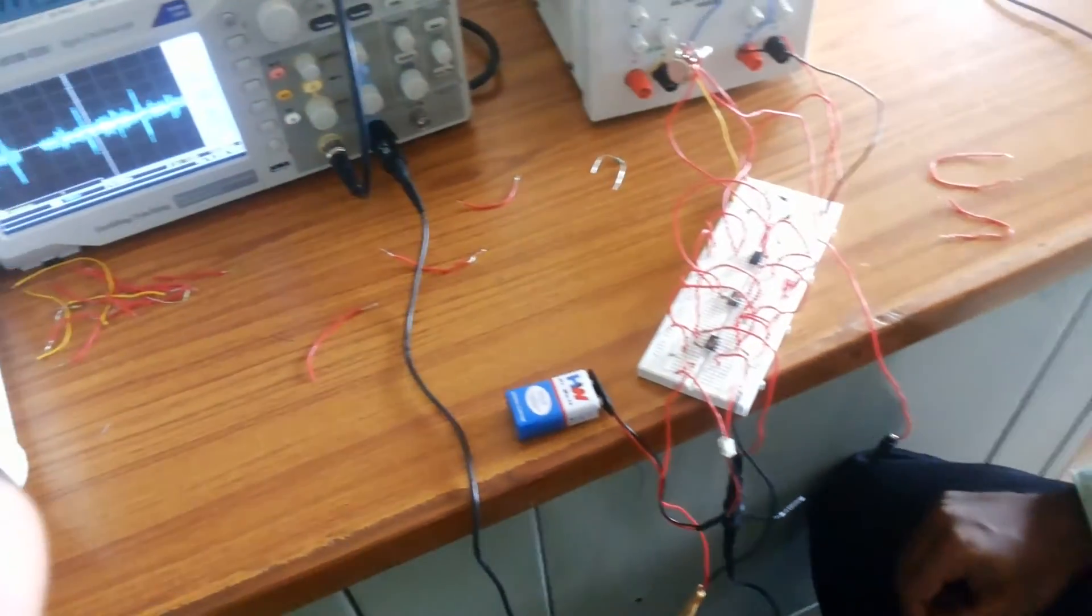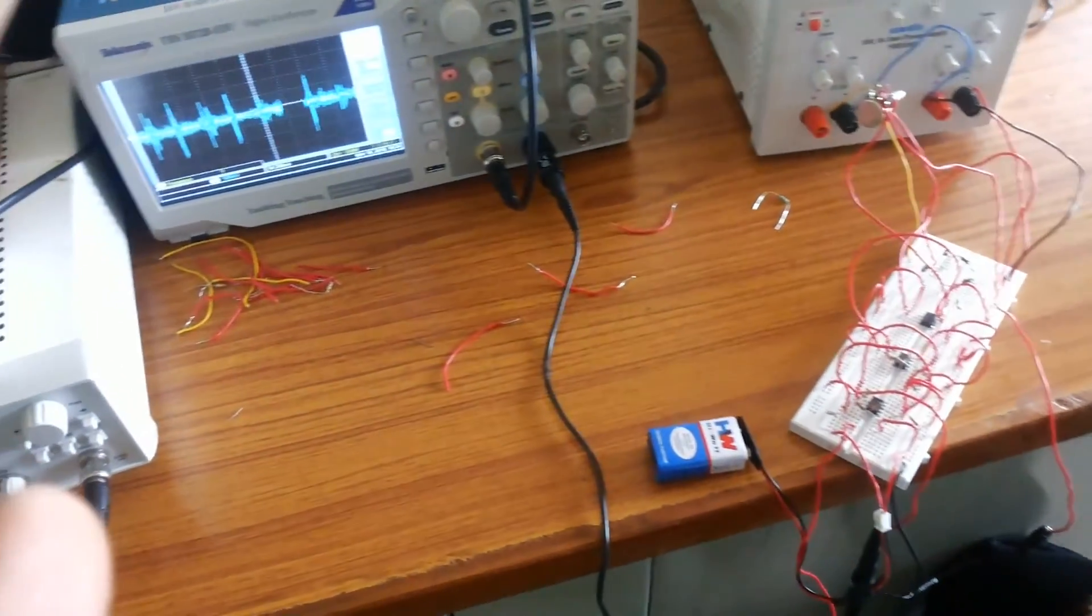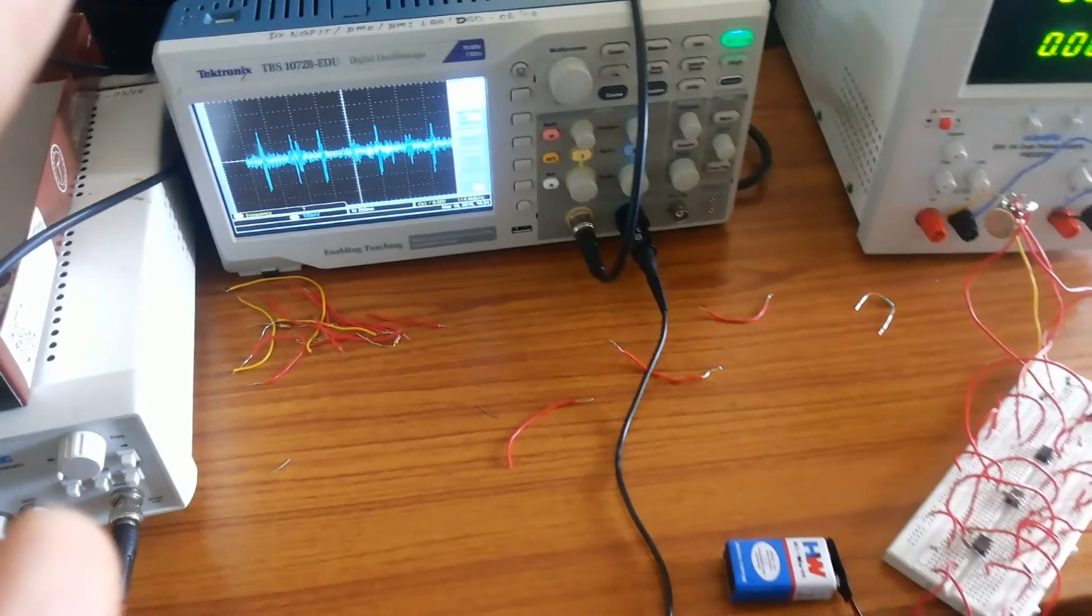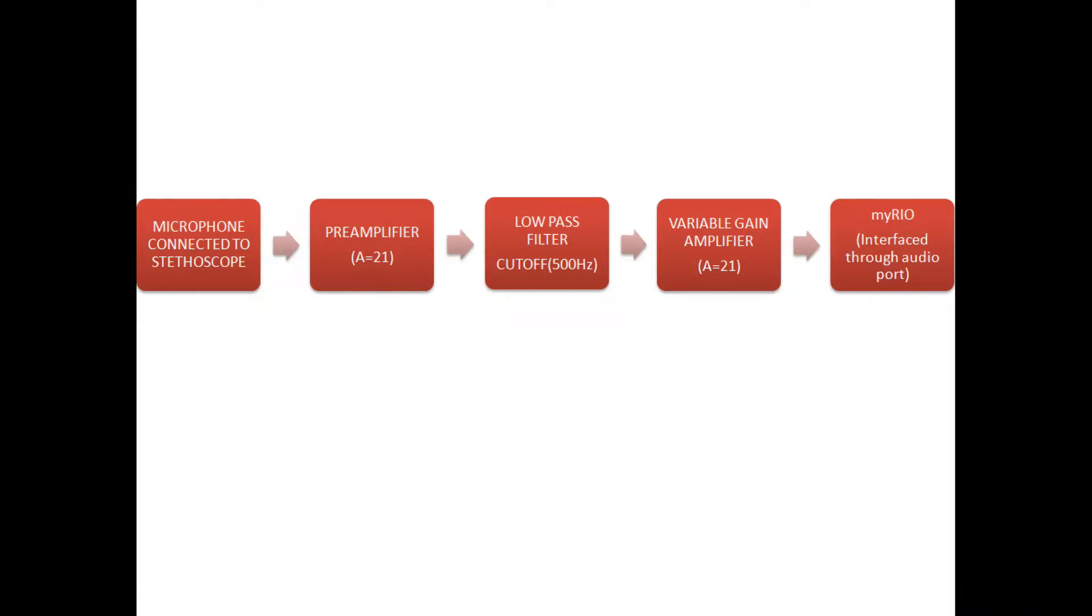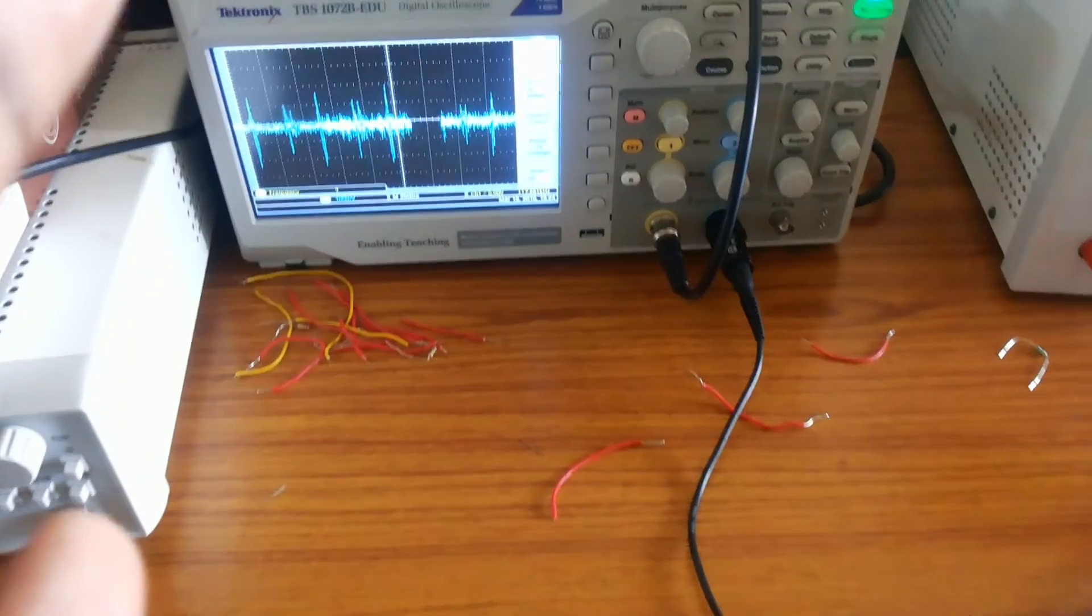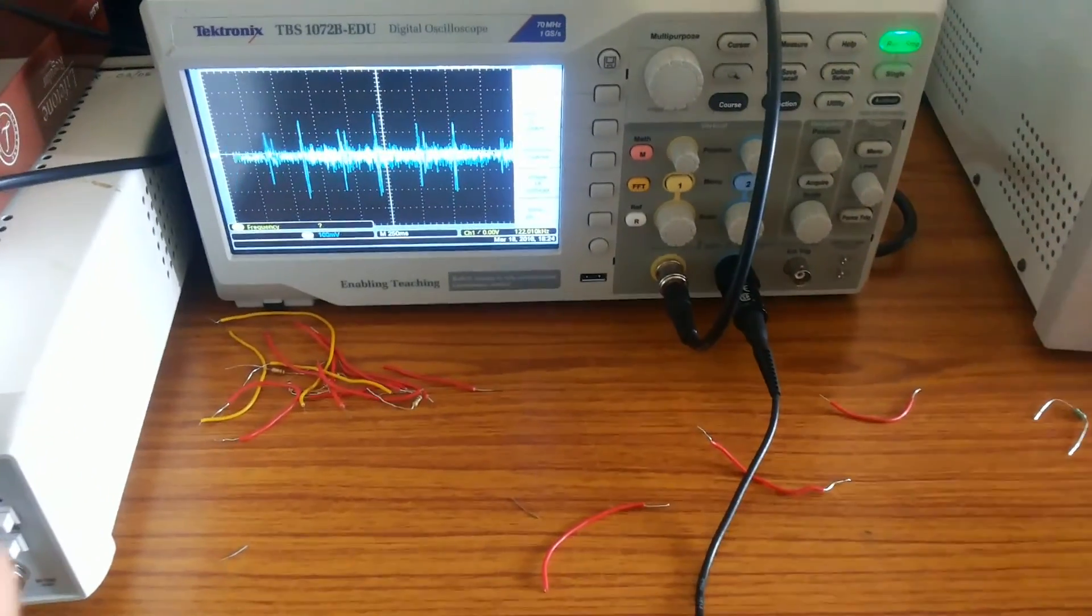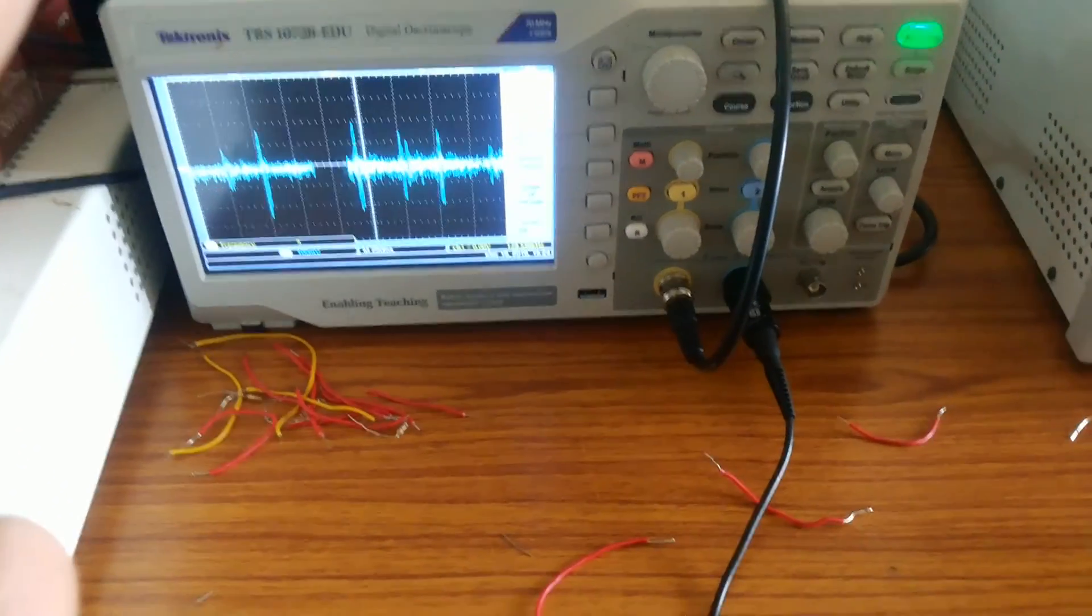This electrical signal runs through the signal conditioning system where the pre-amplifier initially amplifies the signal to avoid data loss. Then the LPF filters the signal to remove noise. Next comes the variable gain amplifier to amplify the signal according to our needs. The output after signal conditioning is what we are seeing now.